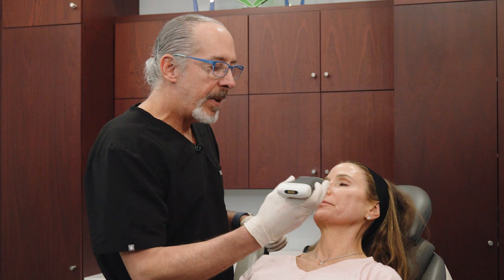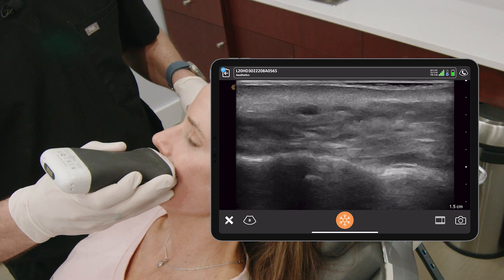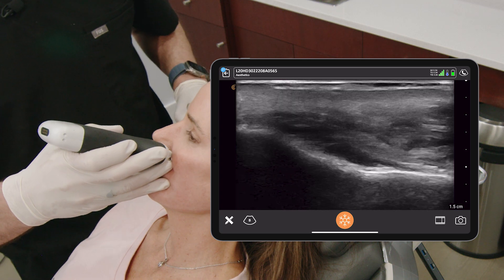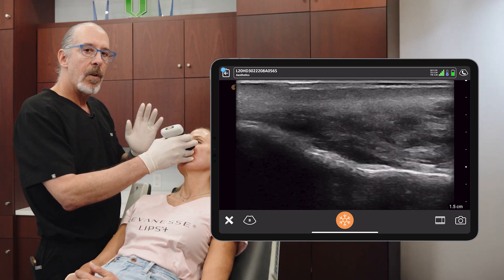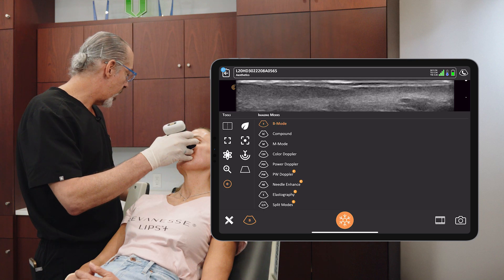I like to examine it this way — horizontally. Remember the notch to the patient's right. What we're looking for here is basically the angular artery. You want to see if the angular artery is laying on the bone or if it's in the SMAS area — so off the bone. This is mainly a vascular study.